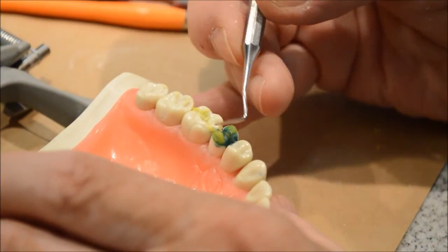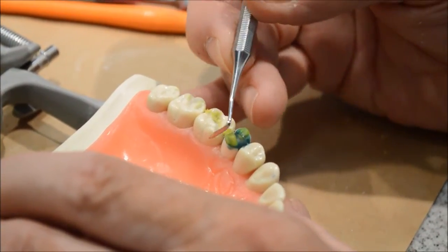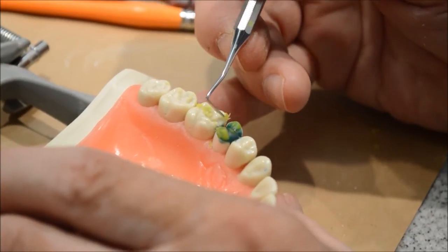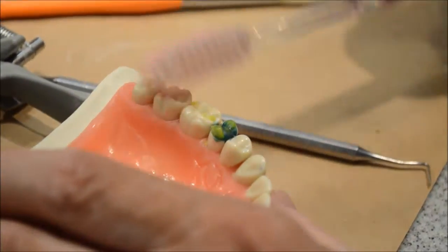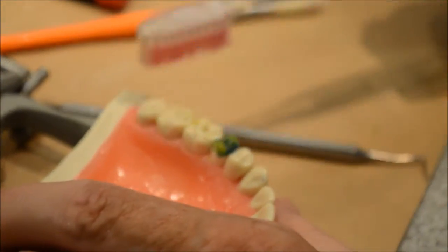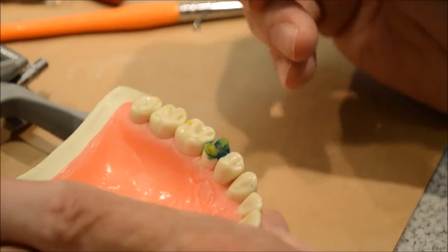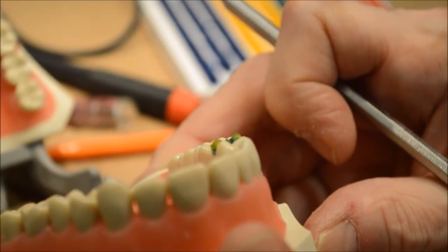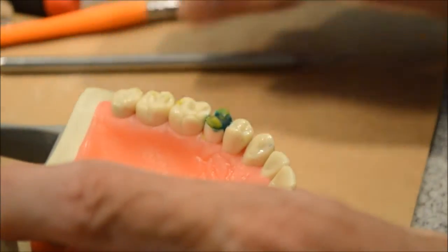I'm going to cut this down just a little bit because I'm going to put what we call cusp ridges on. You see, it gets kind of messy, so I'm going to use a toothbrush and clean it off. Now I'm going to check again to see if my cusps are the same height, and I think they are — so I'm going to go ahead and put what we call cusp ridges in.